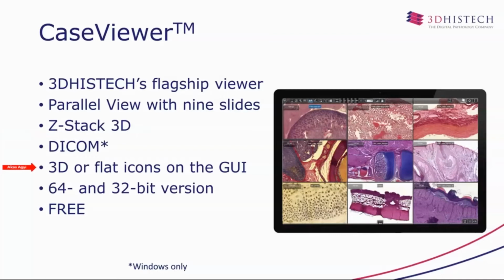We have three-dimensional or flat icons, so basically anybody can set this software according to his or her taste. The software is freely available for download from our website in 64 and 32-bit versions.